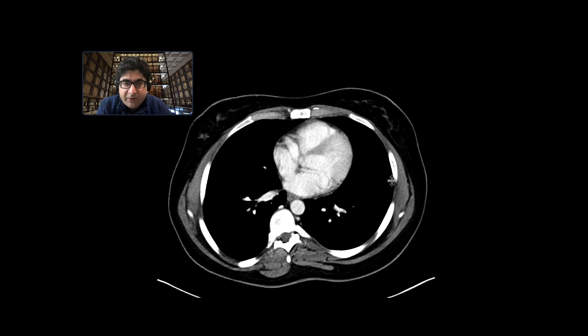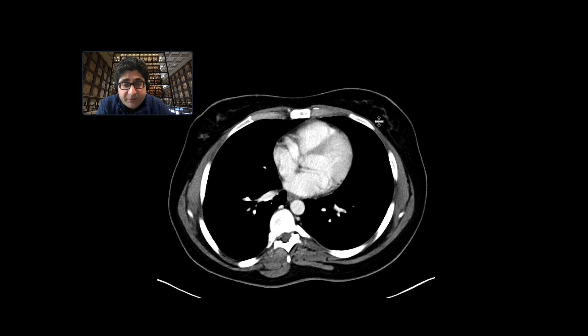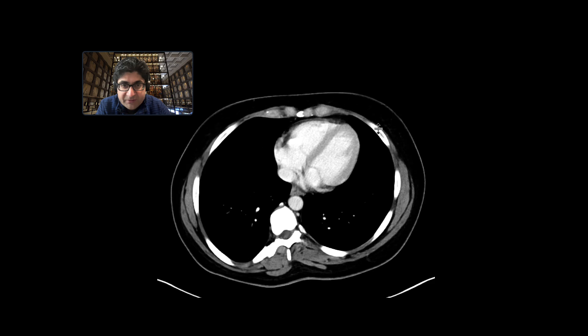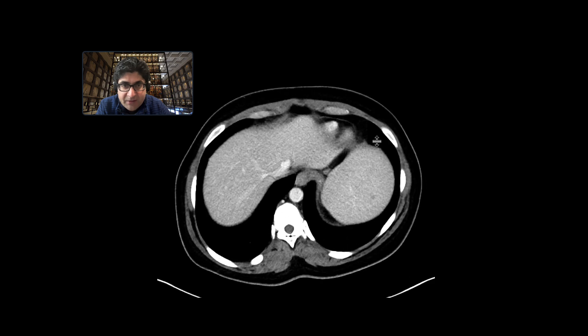This is a patient with a history of melanoma who is here for routine staging. We did a CT scan with intravenous contrast to evaluate for the presence of metastases.